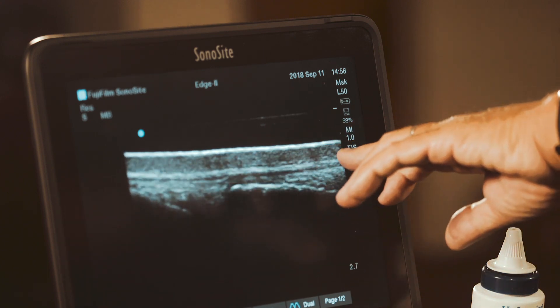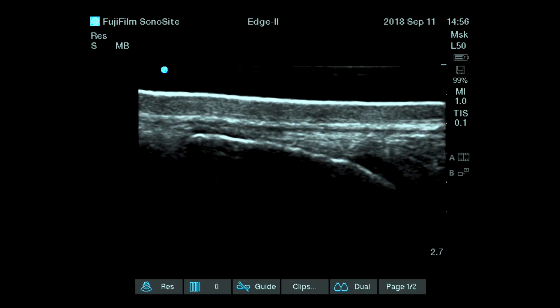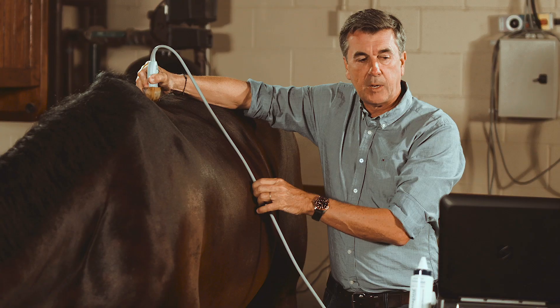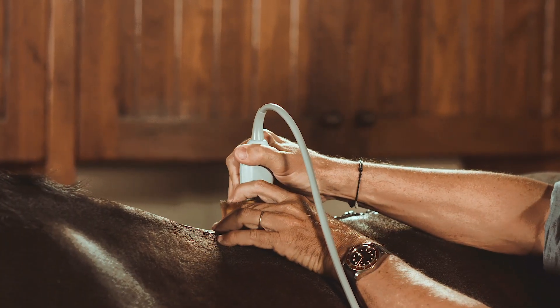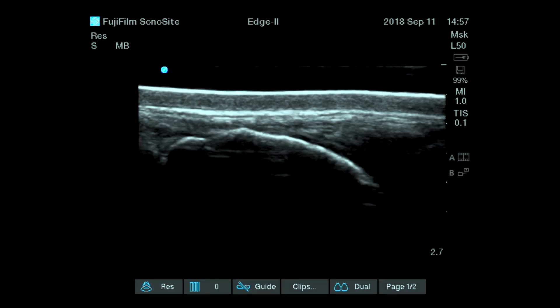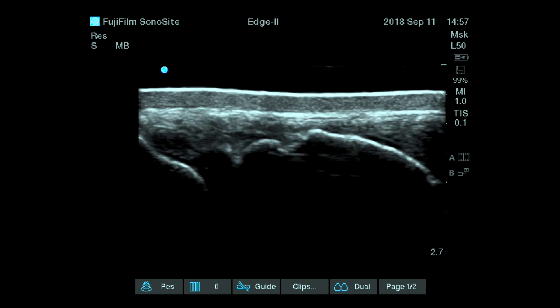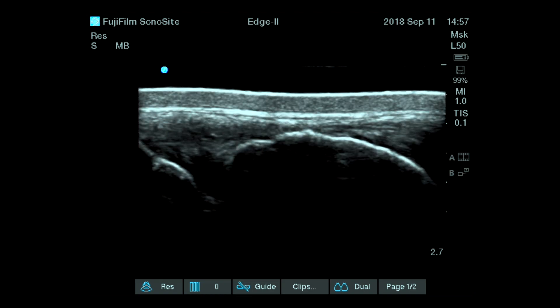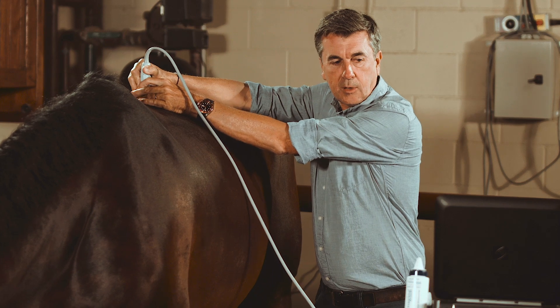The ligament will be just below the thoracolumbar fascia. Each fiber of the supraspinous ligament will eventually orientate a bit more ventrally to insert on the next spinous process. You want to have this view and get to see a nice shape of the top of the spinous process, see the fibers in between, and check if these fibers are well aligned and have good echogenicity. Between each spinous process, you can see the ventral fibers orientating more ventrally to insert on that spinous process.